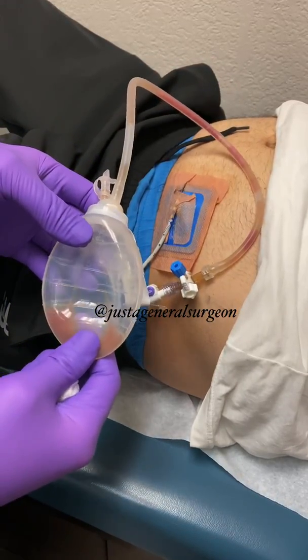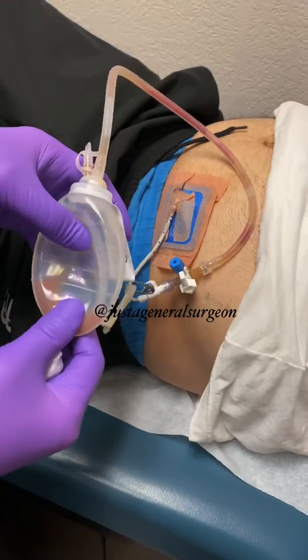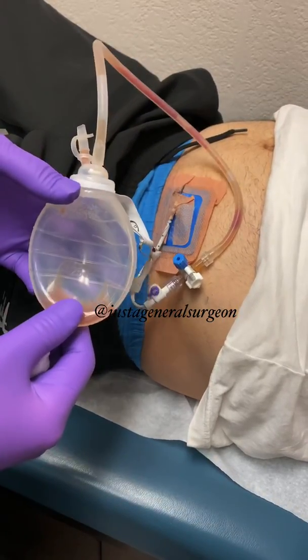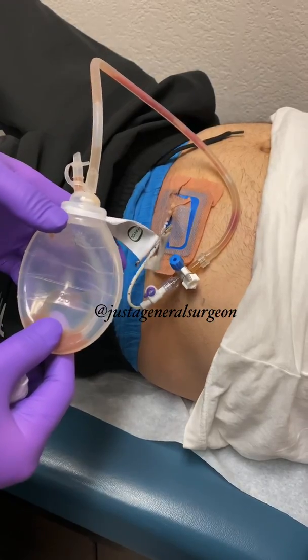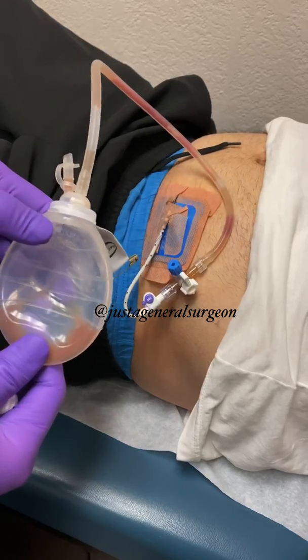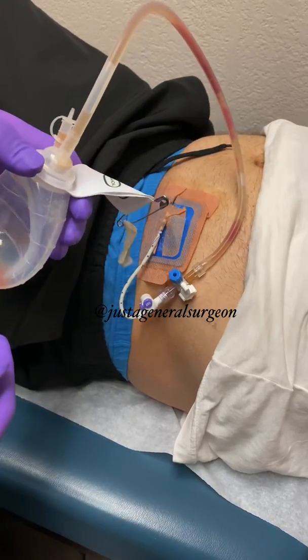This is the collection bulb. You can see some fluid in there, which is consistent with what you'd expect to come out of an abscess cavity. This has not been emptied in two days, so the amount coming out is very, very minimal. So it is time to remove it.